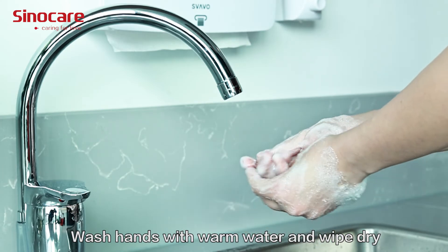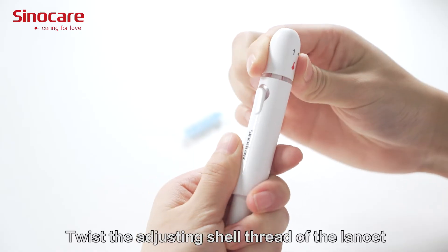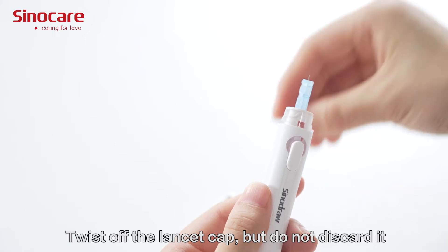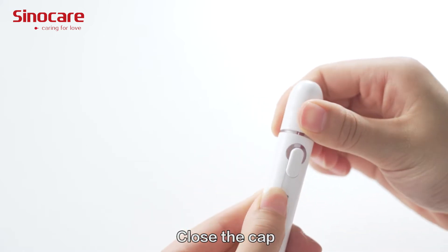Wash your hands with warm water and wipe dry. Twist the adjusting shell thread of the lancet and insert the lancet into the core rod. Twist off the lancet cap, but do not discard it. Close the cap.